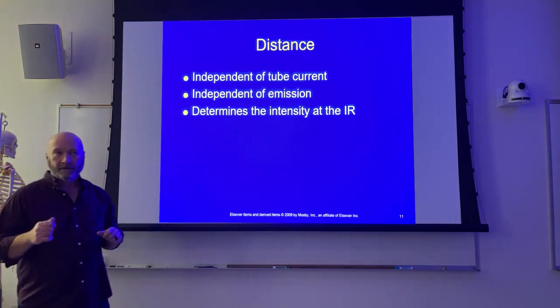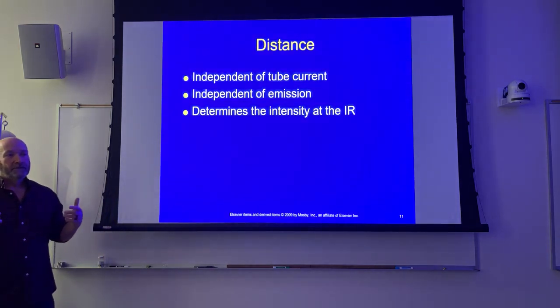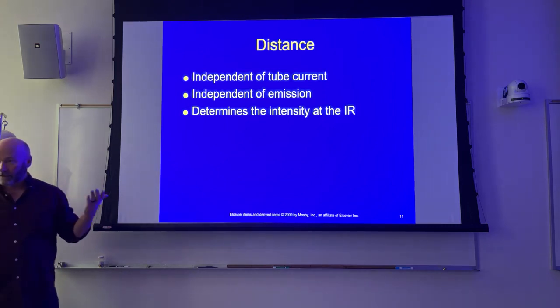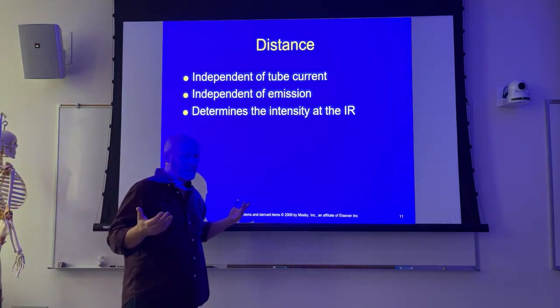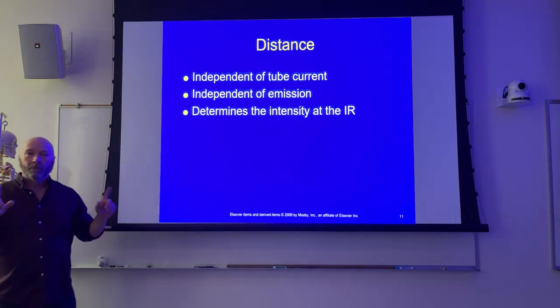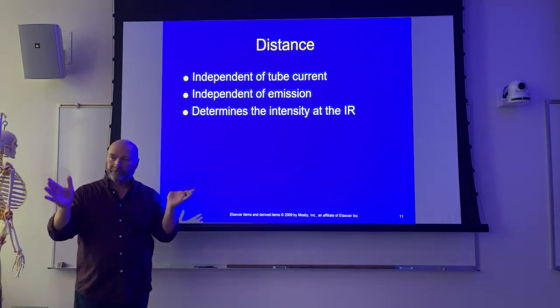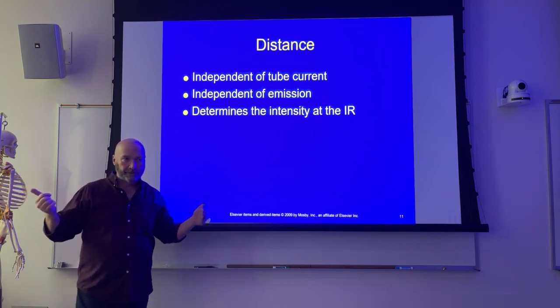Now, let's say we're doing the same patient in the department. Okay, so you make your exposure at 40 inches. You're doing AC joints, let's say. You remember talking about AC joints? Maybe it was on video because we didn't get into bony thorax. But one problem with shooting AC joints is because of the divergence of the central ray at 40 inches, you may project the AC joints off of the image receptor.